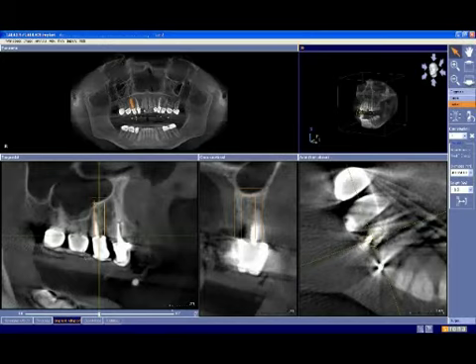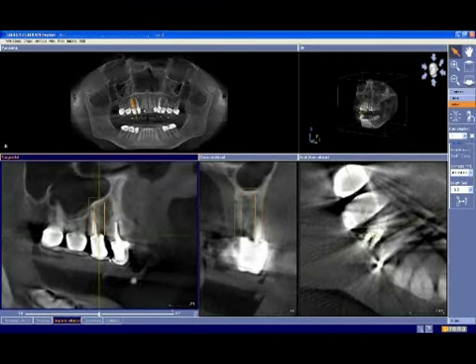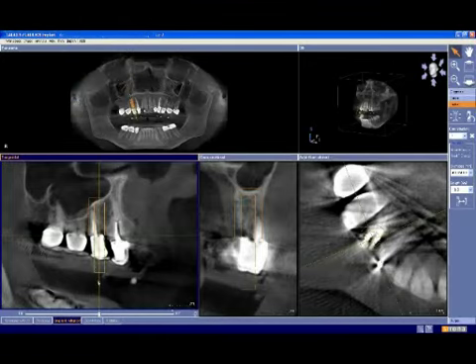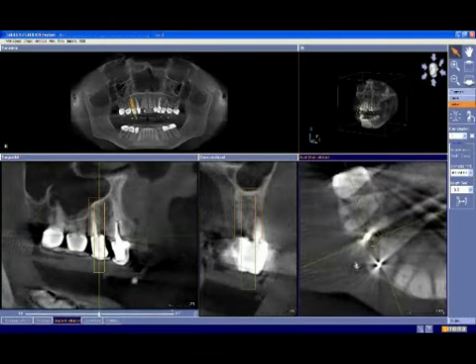Now we go to the implant align screen, and we can do some further tweaking to make sure that we have this implant aligned just the way we want it to be. There, I superimpose it over the adjacent tooth again just to make sure that we're going to be parallel. And we see that the center line of the implant goes right through the center of the crown as we want it to do. We add a projection of the final drill, which verifies that we are going to be centered nicely within the crown, although I'm going to do a little bit of fine-tuning here just to make sure that the position is as precise as we can get it to be.